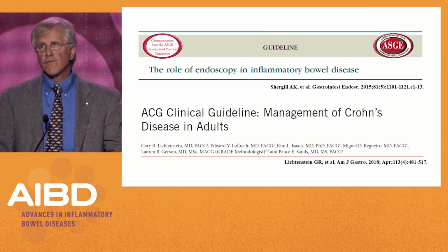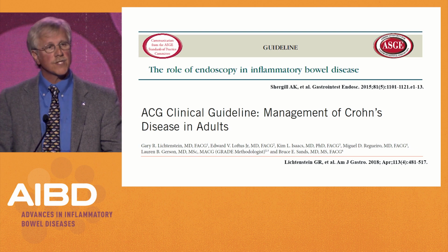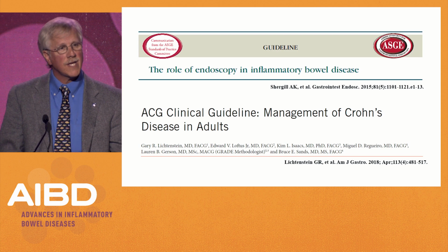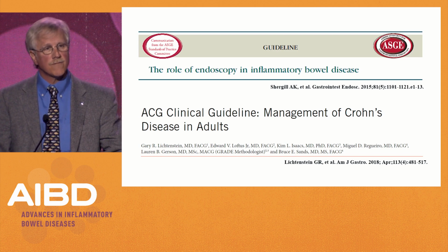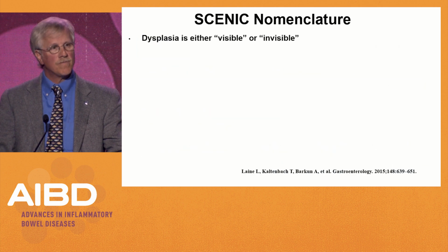Another very good useful reference would be this paper that was published in 2015, The Role of Endoscopy in Inflammatory Bowel Disease, that was in GIE. And then finally, we'll talk about the recent ACG recommendations for surveillance for IBD that were published in the American Journal. So first, let's go over some nomenclature.